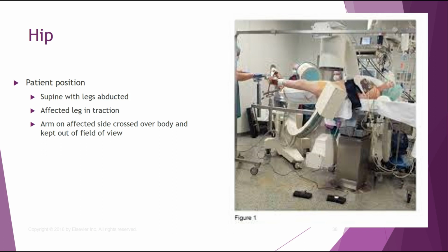And they're going to call you in there, first of all, to usually take a picture before they start. And then they're going to want you to take a picture when it has been reduced and in a good position if possible. And then next, they're going to put some hardware in there, and they're going to want a picture with the hardware in there to make sure everything looks good before they wake the patient up. Okay, so you're going to be in a hip surgery several times usually.